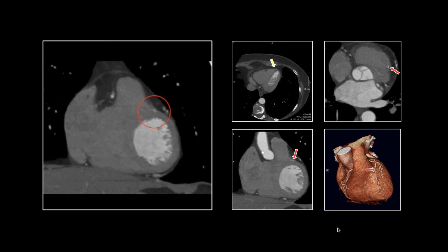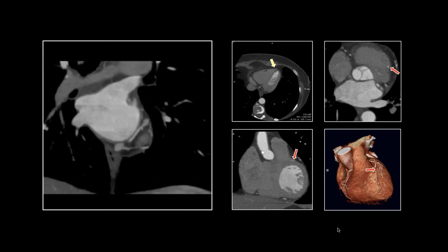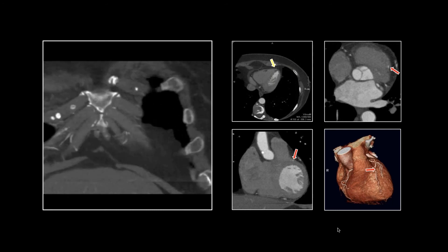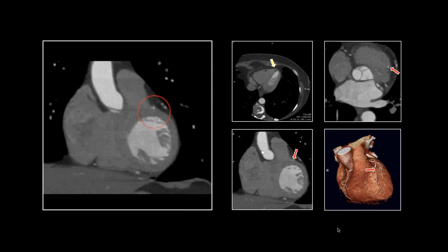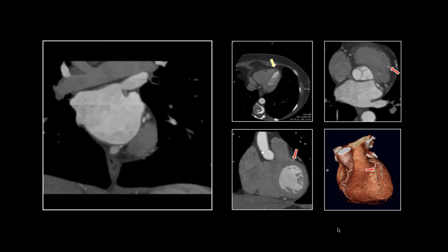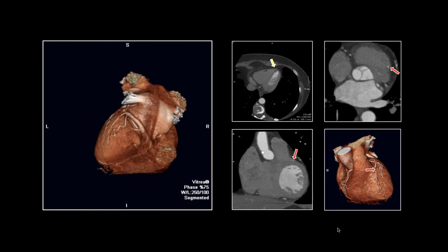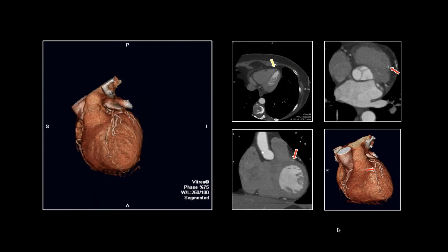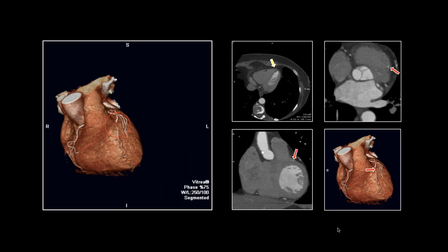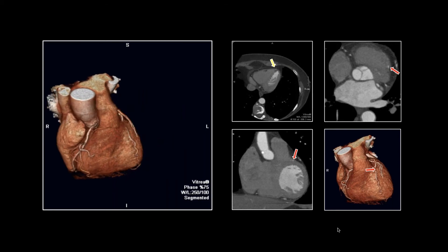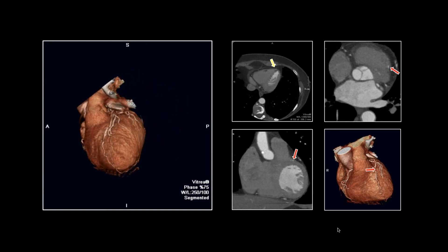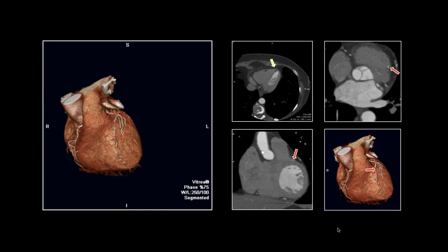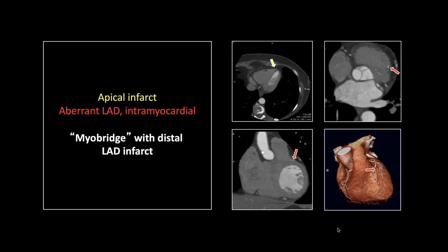And here it is diving into the myocardium — really nice depiction. There it is in the myocardium right there, and there it is proximally. The surface shaded is really helpful here; you can see that segment where it just dives in — that's probably the best view of it. A myobridge with a distal infarct.